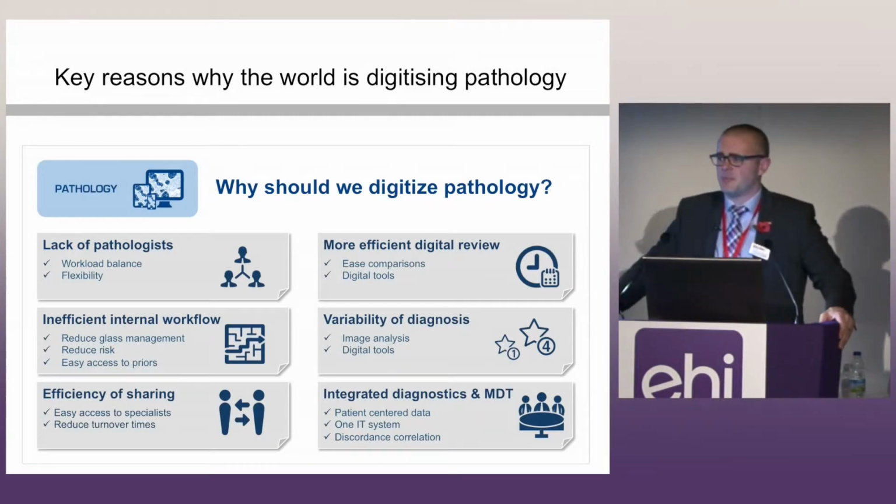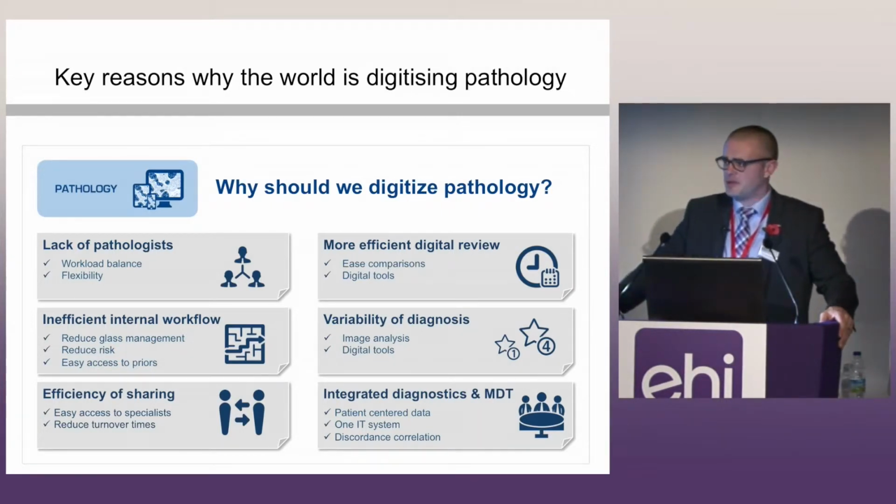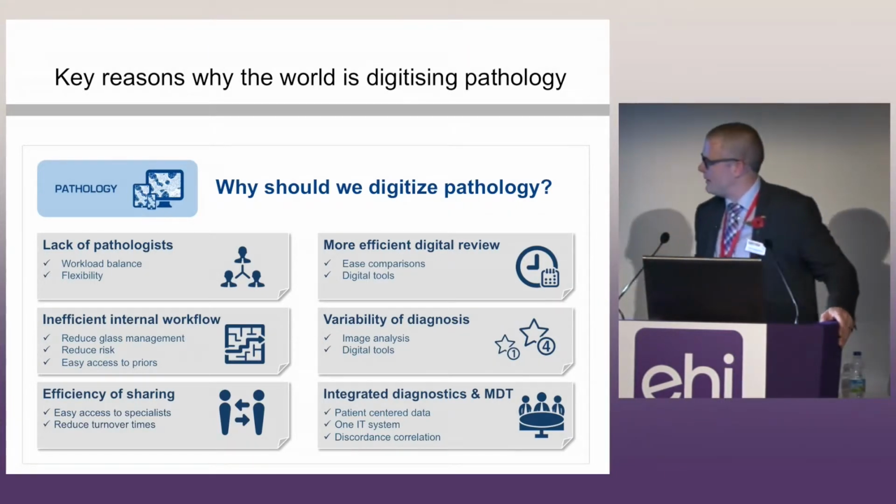As we've already touched upon, there is a lack of pathologists within the profession right now. That makes it very, very difficult to balance workloads, to provide flexibility of service. Digitising the process really makes it much more efficient to move those images to the pathologist for reporting.